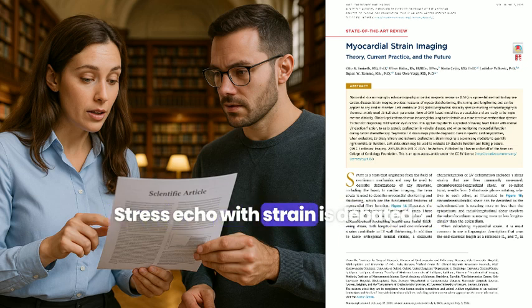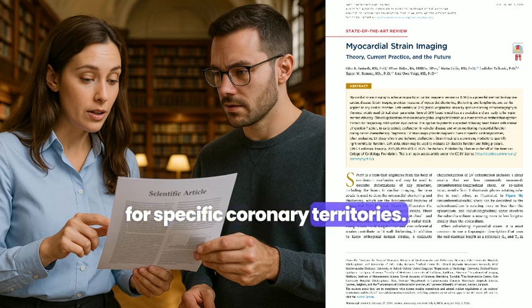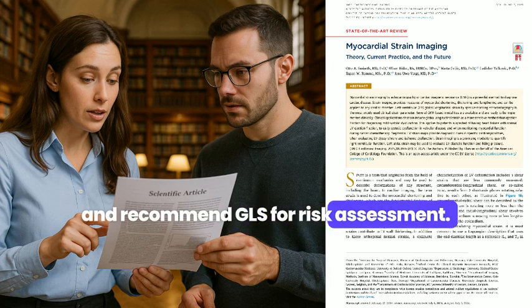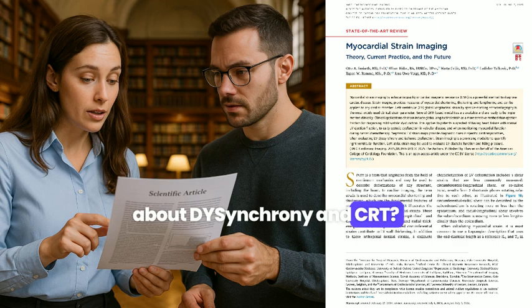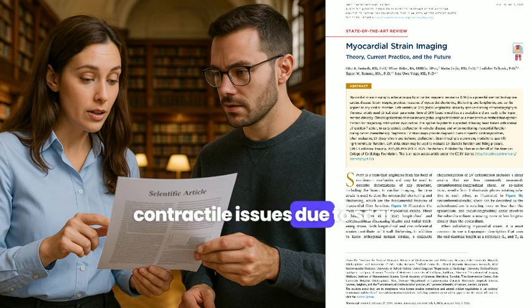Yeah. Stress echo with strain is debated: challenges with high heart rates, motion, lack of clear cutoffs for specific coronary territories. But ESC guidelines suggest a role if EF is normal, but you see regional dysfunction, and recommend GLS for risk assessment if EF is over 35%. What about dyssynchrony and CRT? Strain is very helpful here. It can help distinguish electrical dyssynchrony, like LBBB, which benefits from CRT, from contractile issues due to scar.